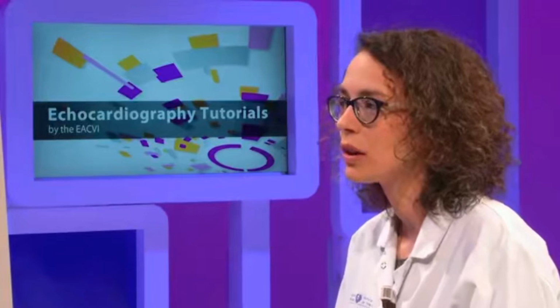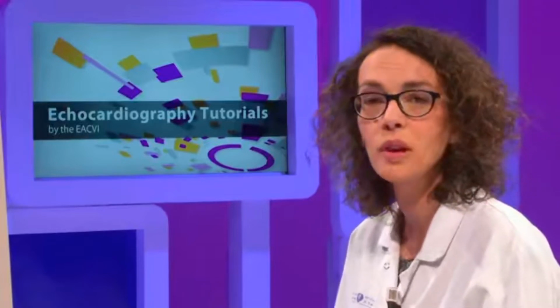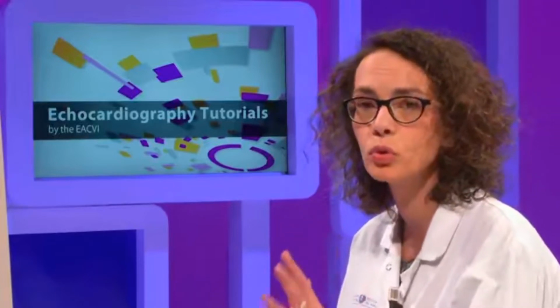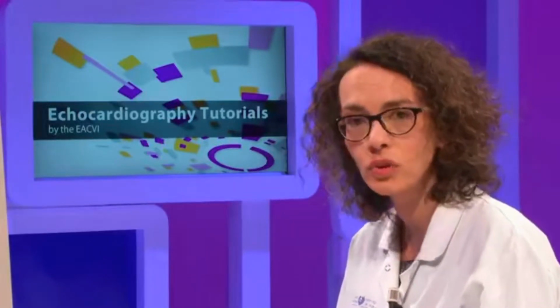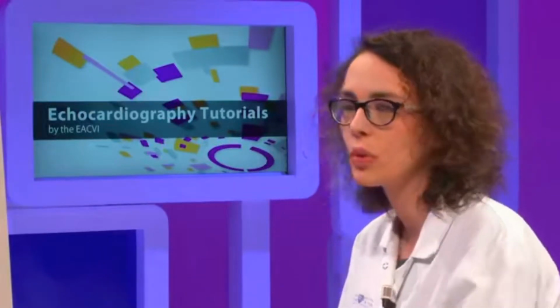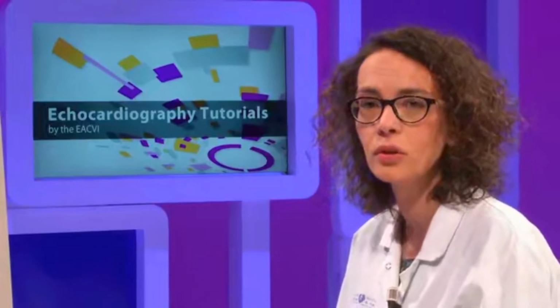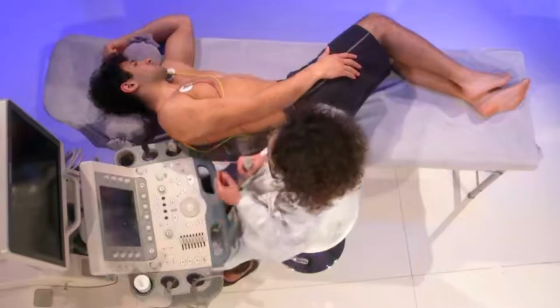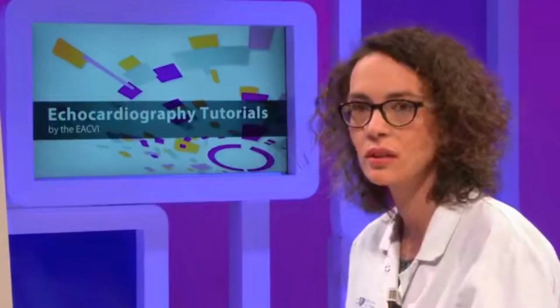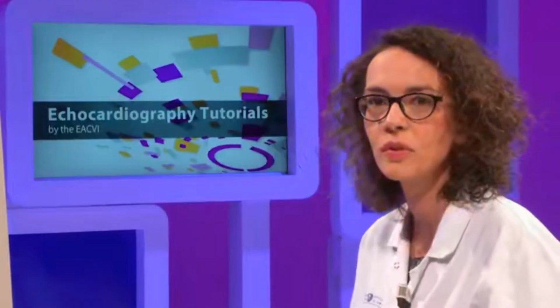And I will take, before the exam, the blood pressure in order to be able to evaluate the afterload of the left ventricle before starting. And of course I need a beautiful ECG recording during all the exam, and to start the patient in the left lateral decubitus position.